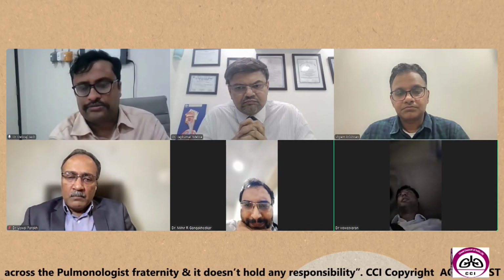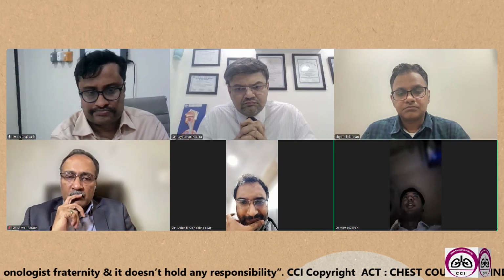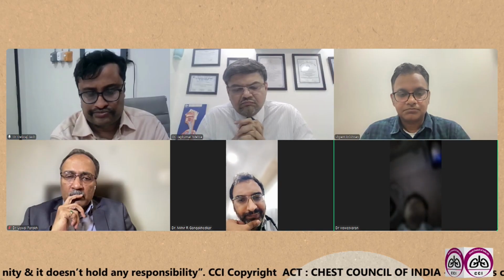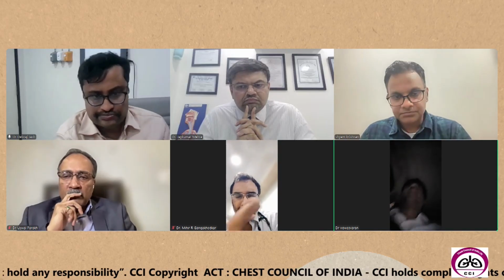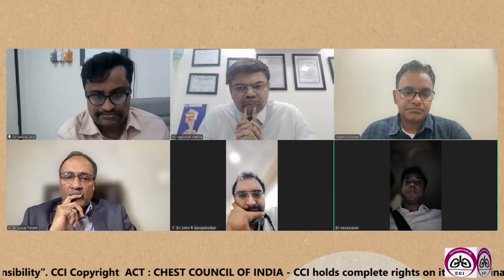Yeah, Devraj, I just have a point on this, because we started doing it. Generally, EBUS doesn't bleed much, because whatever bleeding happens gets tamponaded within the node where you actually sample from.